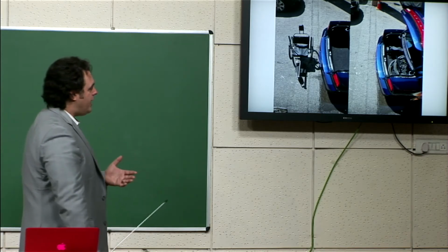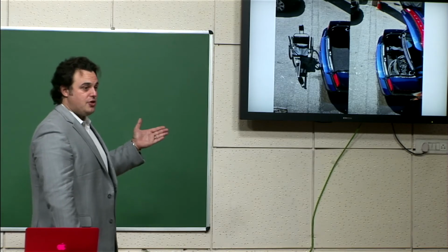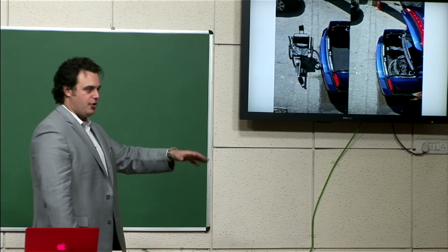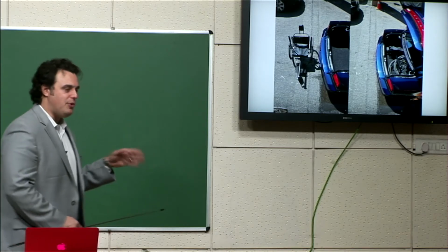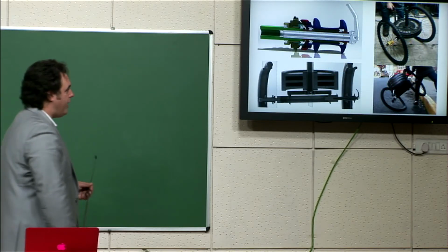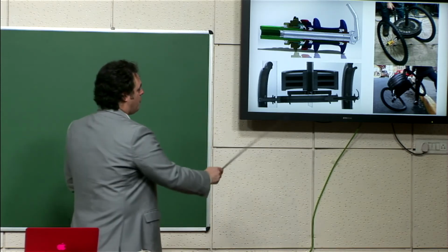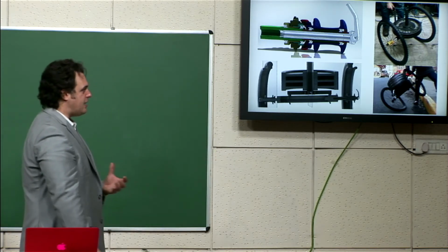Whereas people in the US are probably going to use this more as a recreational device, like a mountain bike. So they want to be able to put it in the boot of their car, go to maybe a park or a national park or a preserve, and then take it out and use it. So we had to make the chair collapsible to fit into the boot of a car. This required substantially more engineering effort to make what became a quick release axle, where you could quickly just take the wheel off the chair. We had to do a bunch more analysis and testing to make sure the wheelchair was rugged enough and the axle system was rugged enough.